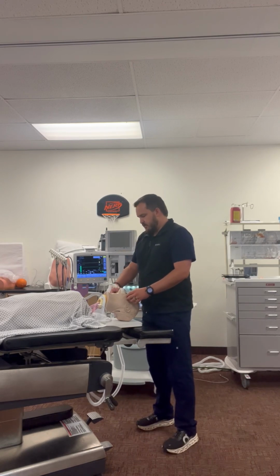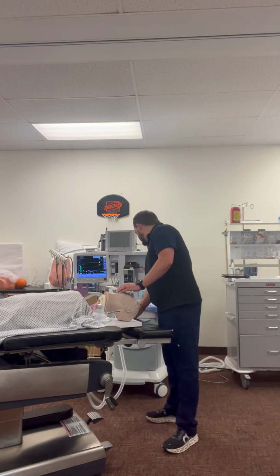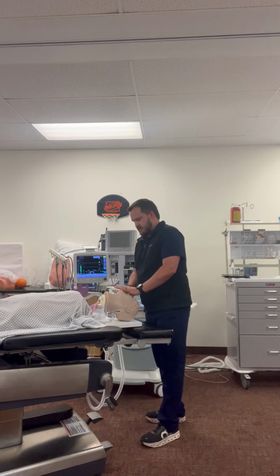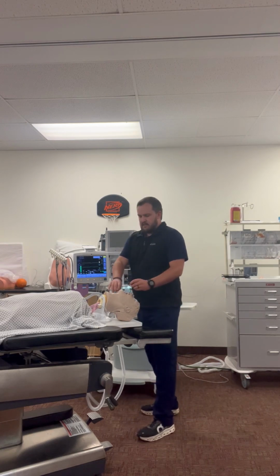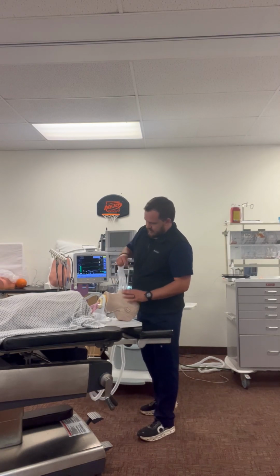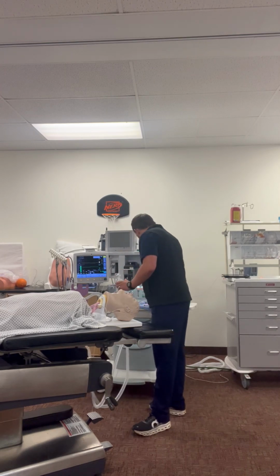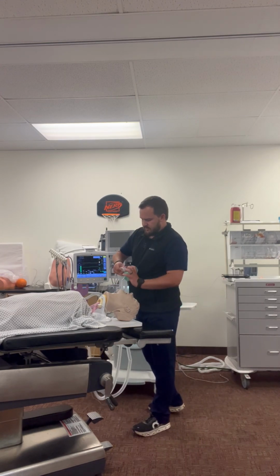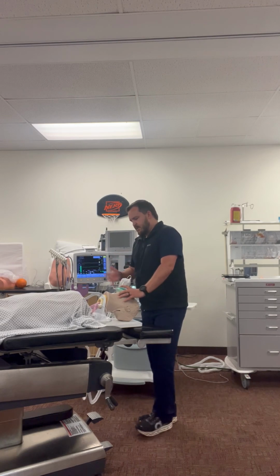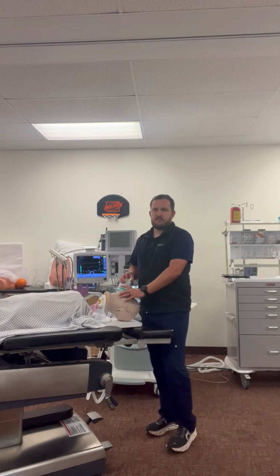So we're going to go ahead and do a deep extubation. So I'll untape his eyes, uncuff the tube. And all our gases are off at this point as well. And then extubate the patient, hook him back up. At this point, I'll just continue mask ventilating and monitoring closely, make sure his airway's good. He should also be spontaneously breathing, so I'll just be helping him if I need more volumes.